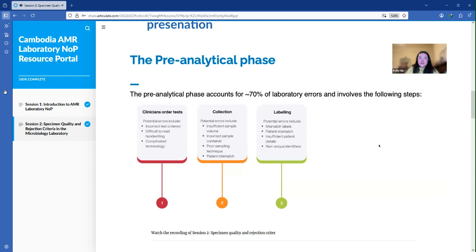Samples which are poorly collected will be determined by the presence of epithelial cells. So this is something that, when we are reading our cultures or actually doing the analysis, we can use this information to determine the quality of the urine sample that is collected.